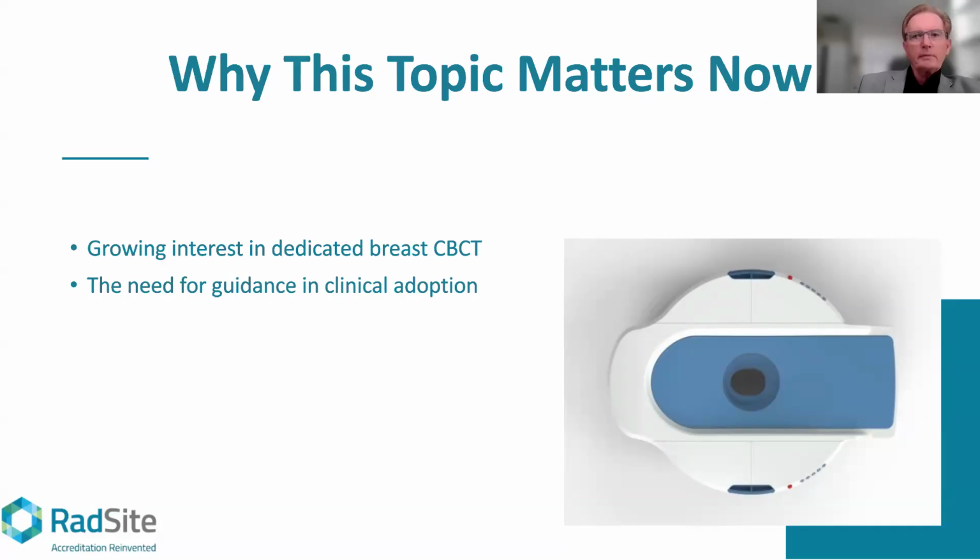Thank you, Dr. Reaven. Dr. Richardson, would you like to add a comment or two about the growing interest in this technology? Well, patients don't want compression, and a lot of patients are post-operative or they have implants, and they want things fast and they want things that are accurate. And one of patients' biggest complaints is having to come back again and again and again for diagnostic images. So to have upfront information in a true 360 three-dimensional format is very helpful.